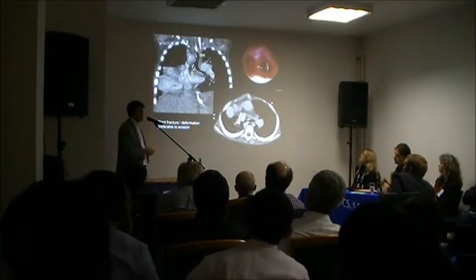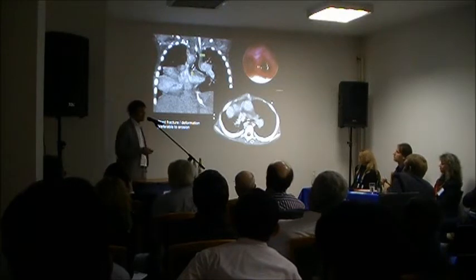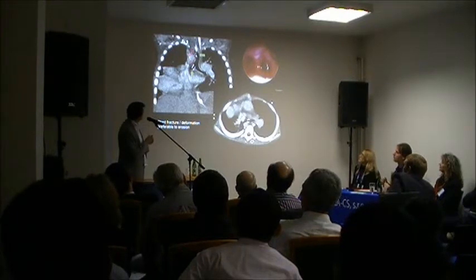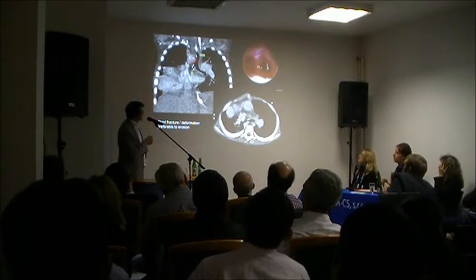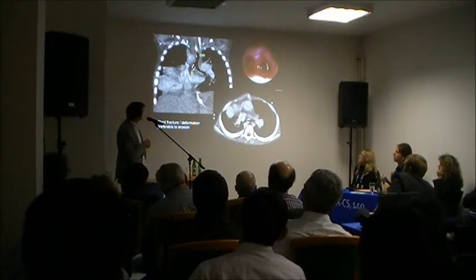Now, in really difficult cases, we end up with a very difficult scenario, which I'm sure the other cases described. This is a patient with very complex heart disease. This is an aorta that's coming right on top of the trachea and the bronchus. It's pulsatile. This child has no chance to survive. We have to put metal stents in the trachea here, in the bronchus. This is 4 years later, so we just leave the stents alone.